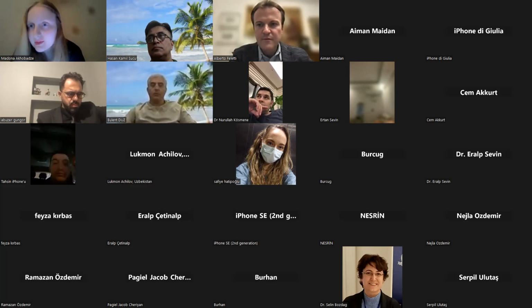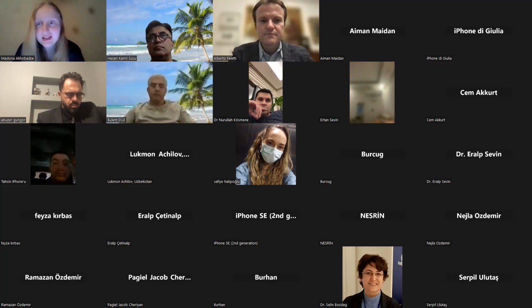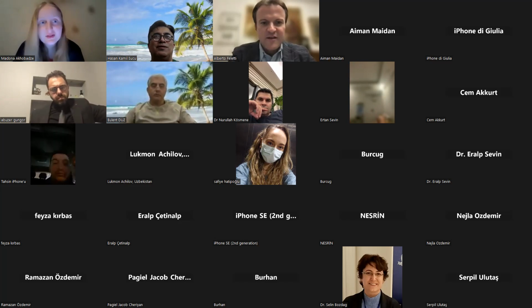Another comment, from Bülent Düz from Istanbul, private practice, is saying flexible endoscopes are not flexible enough. I think that's the comment for the flexible endoscopes. Then we have a female neurosurgeon. If I can comment on this comment.